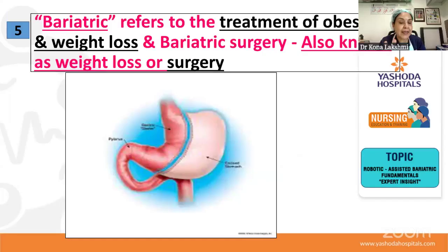So the AI in this cuts down the tremor. Even if the surgeon's hand trembles a little, the AI fine tunes the tremor, and the instrument doesn't shake. But in laparoscopy, for some surgeons, you can see that when they're operating, the instruments will be tremoring like this. So that is reduction or abolition of the tremor. That is where AI works.